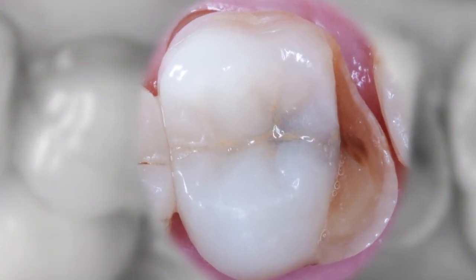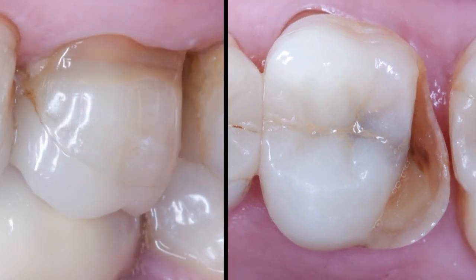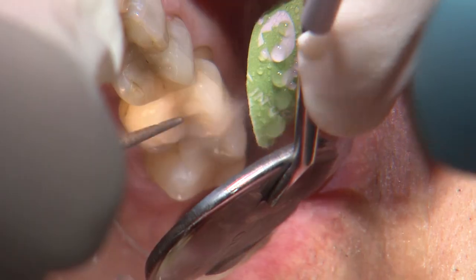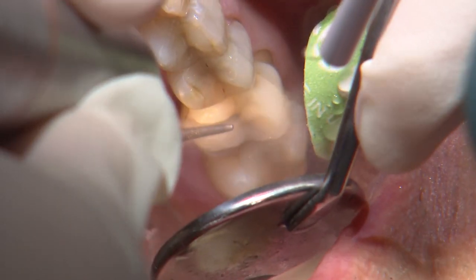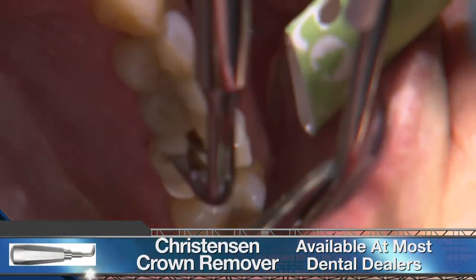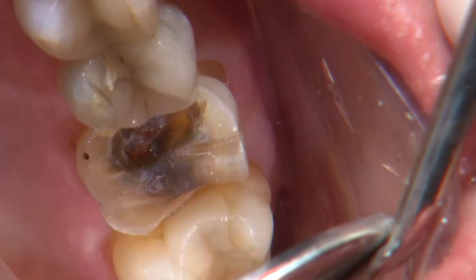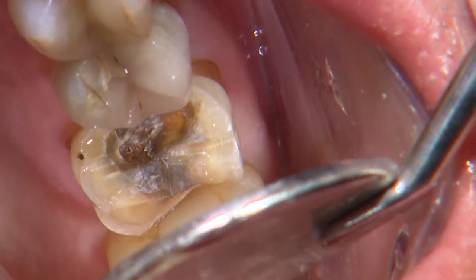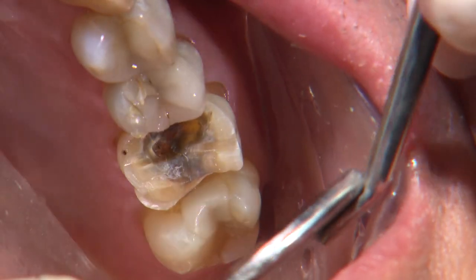My patient presented with a fractured all-ceramic restoration on his upper left first molar. With most all-ceramic restorations, we can pretty much assume they're bonded in adhesively, often requiring multiple slots to reach the prep beneath. After the slots are created, I use a Christensen crown removal tool to separate the sections off the tooth. By air drying the tooth, you can also get a better visualization of any remaining cement, which I prefer removing to have a fresh tooth surface to cement to.